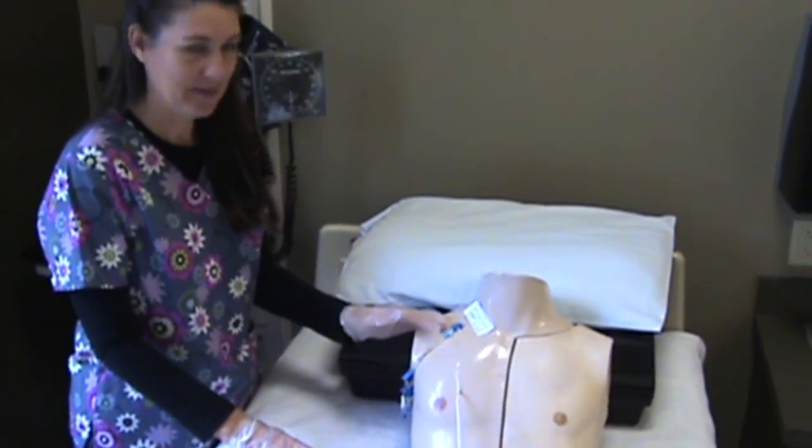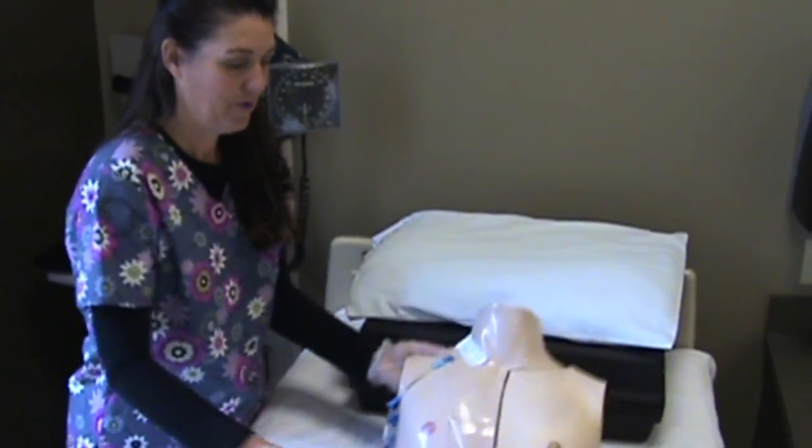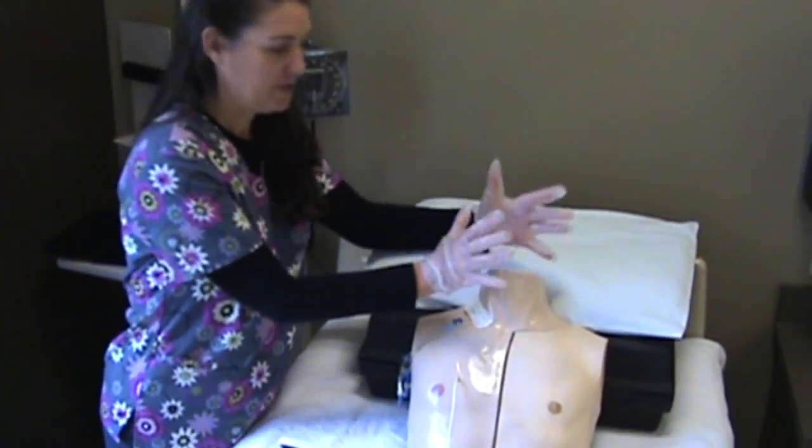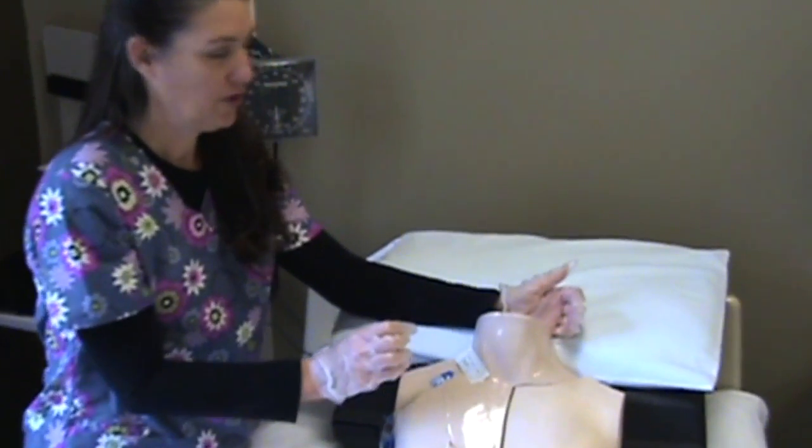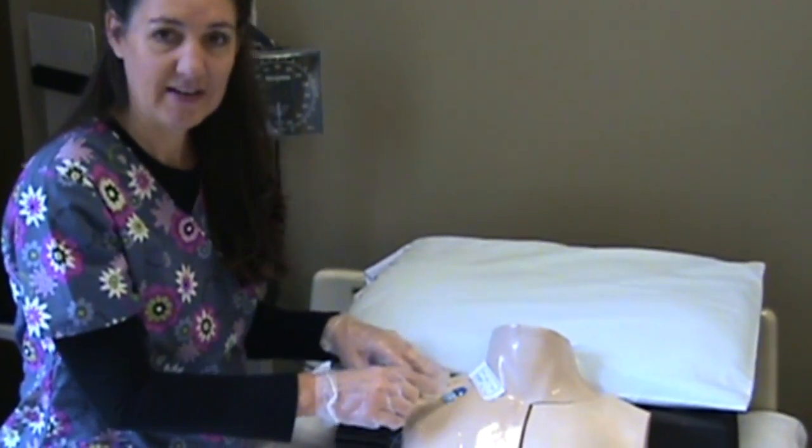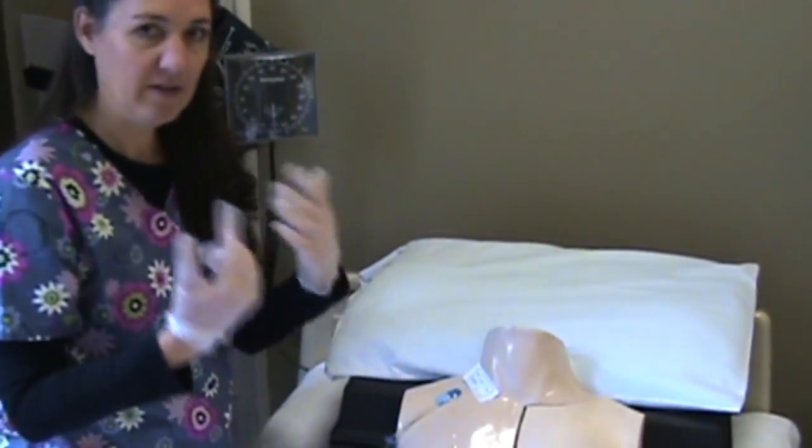I'm going to put the patient in semi-Fowler's position, which is not high Fowler's or low Fowler's but semi-Fowler's. Then I'm going to turn their head away from me so they don't cough on their site and get it infected. If they need to, we'll put a mask on them.